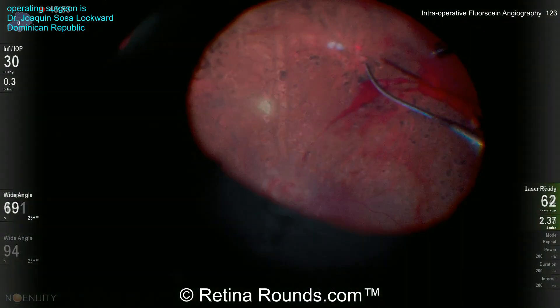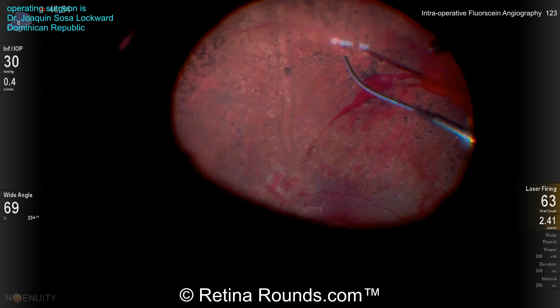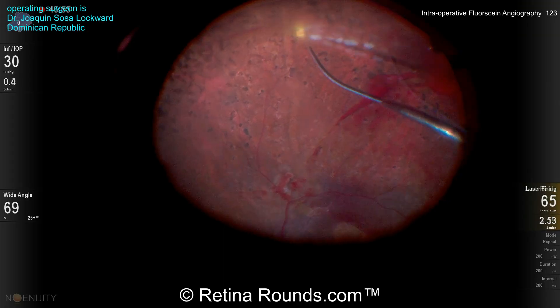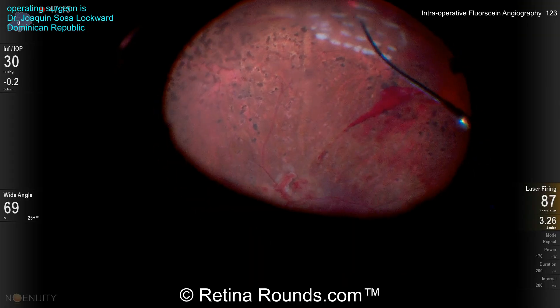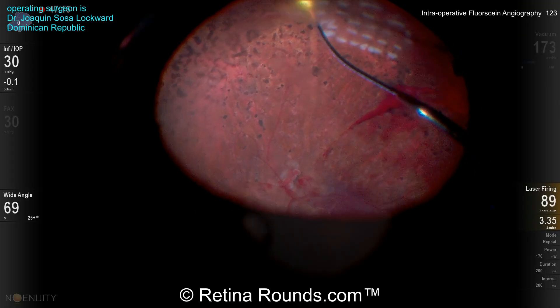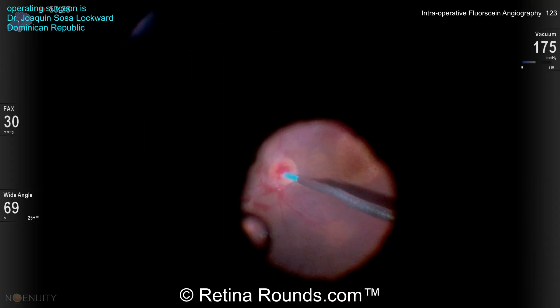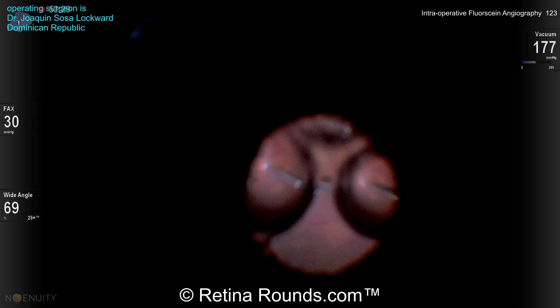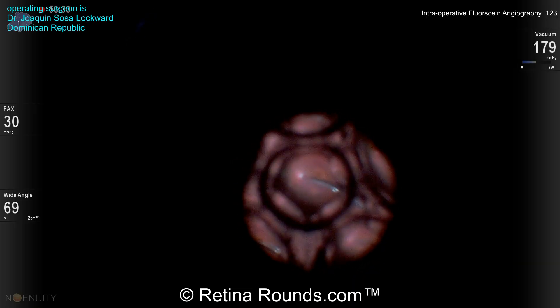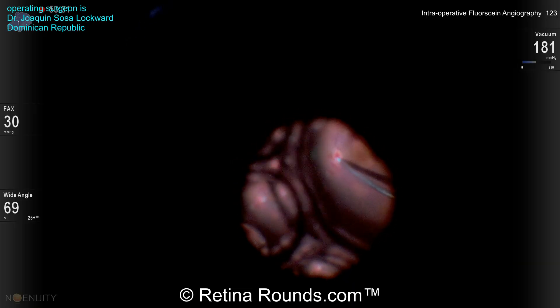He's applying some additional laser to areas that were maybe not as completely treated previously. An air-fluid exchange is performed at the very end of the case.